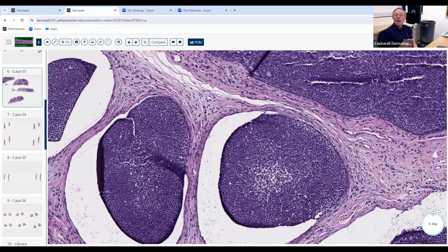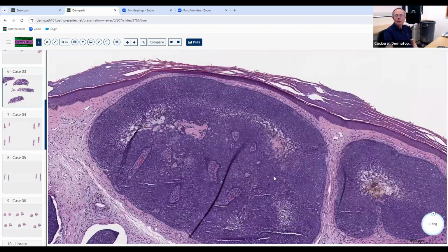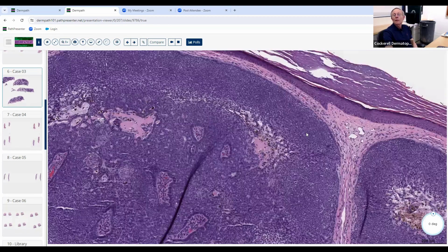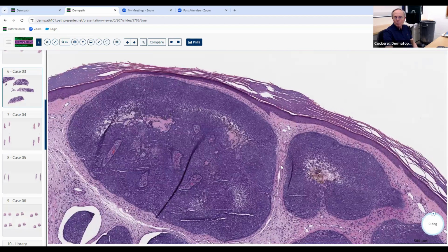It's not just a histologic artifact, which is interesting. So when you see that, it's a clue to basal cell. But if you just saw this lesion up here, you'd say, well, gosh, that doesn't look like a typical basal cell. It doesn't have any clefting here at all. It does have the peripheral palisading of the nuclei, but it sure doesn't have any clefts. So don't just say, well, just because it doesn't have that, it can't be a basal cell carcinoma.